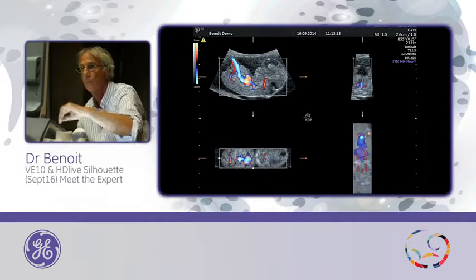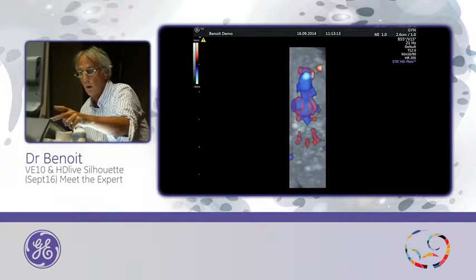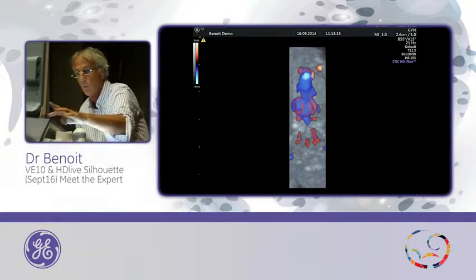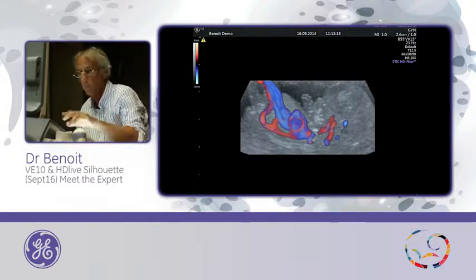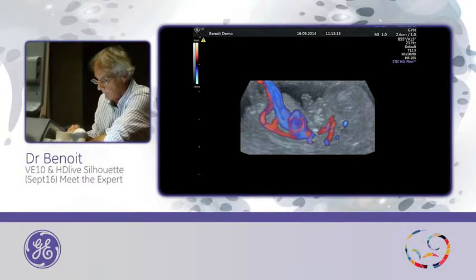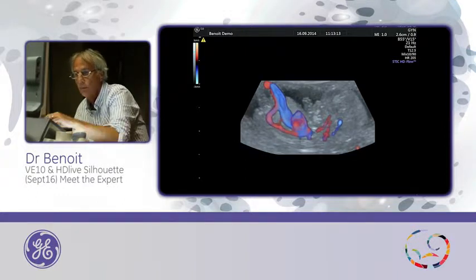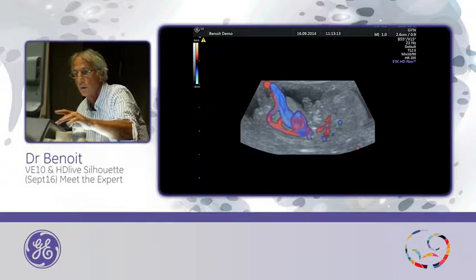And for this embryo, I did also this. This was a STIC acquisition with a color Doppler. So I change the position of the region of interest. I have to go main, sub, this one. Because it was a STIC, I can activate and start movement, reduce the size.